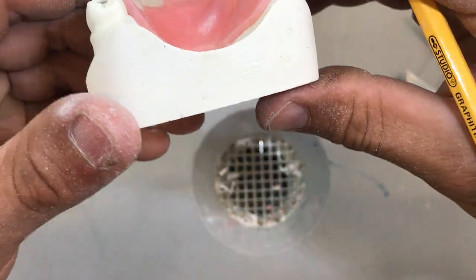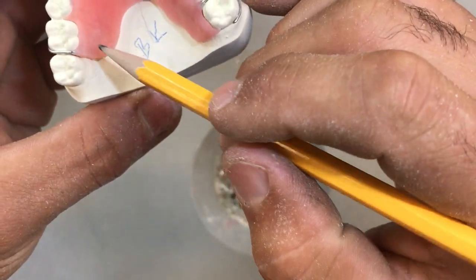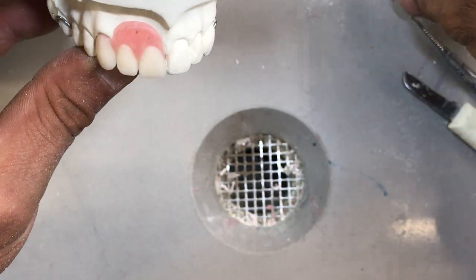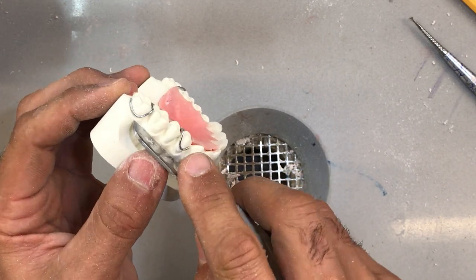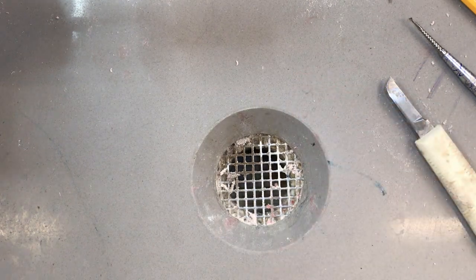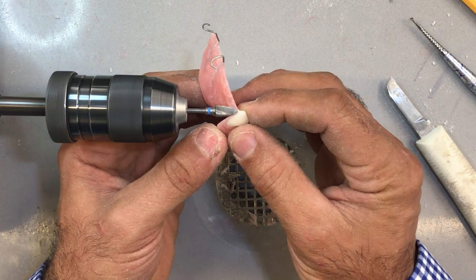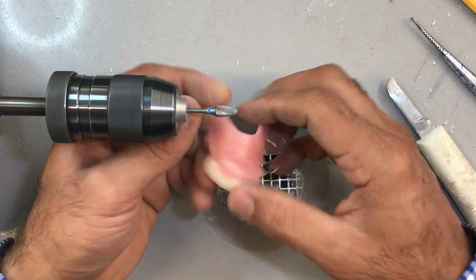It's sitting right up against the palate, fairly flush. The only thing I've got to do now is trim the inside a little bit and taper it — just give it an overall smooth look. Touch up a little bit on the flange here, like we do for full dentures, and we are ready to polish. Very little adjustment to the margins, if any at all, because I took the time to have nice clean margins with my wax up.